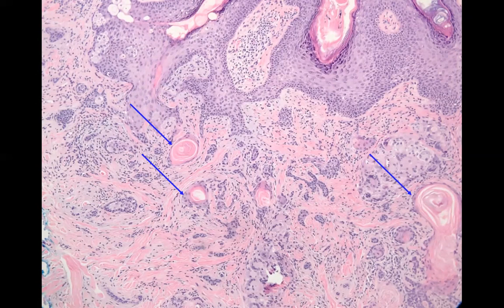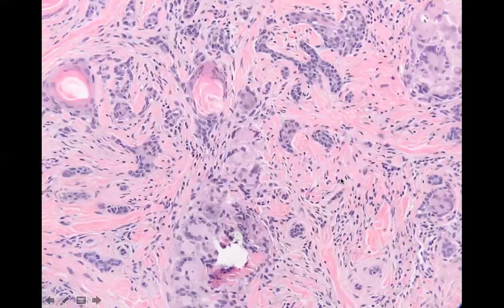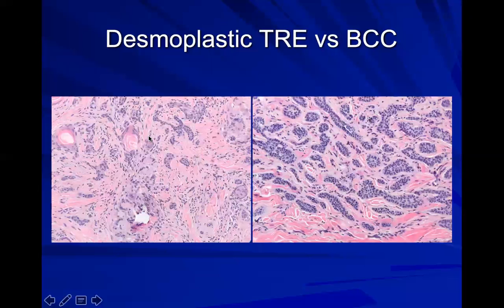Again, cystic structures. See, here's a granuloma because they can rupture. Little granuloma, little basaloid epithelial structures. This is a basal cell. You see it's got this slightly more blue edge, but it can be pretty hard to distinguish them.